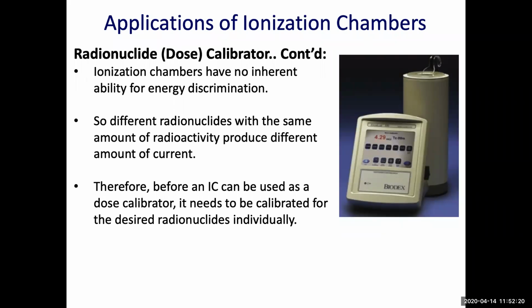So the amount of ionization inside the ion chamber, which is the dose calibrator, will be different. It will be higher for iodine-131 because iodine-131 has higher energy, 360. So 360 will give a different reading, different ionization will occur inside the gas, while technetium also interacts with the gas, but in a different way, because different energy gives a different number of ionizations. So the signal will be different, and when we convert the signal to activity, it is also different. So we will not get accurate activity.